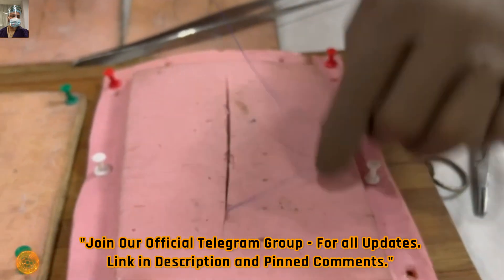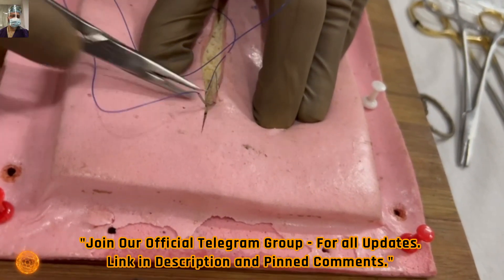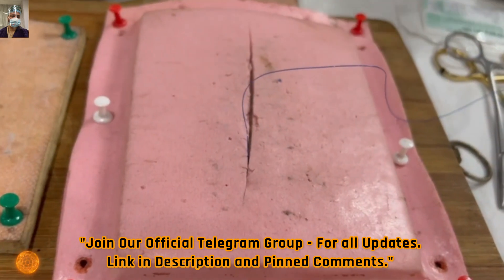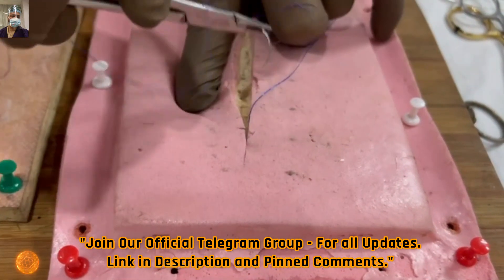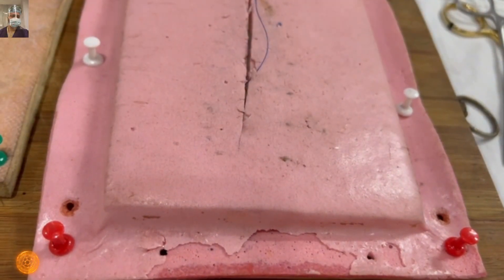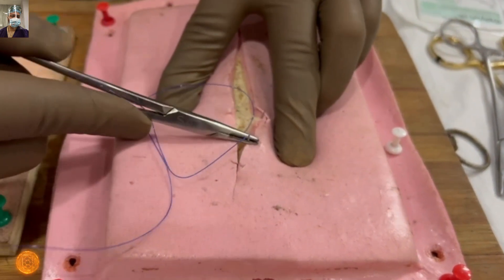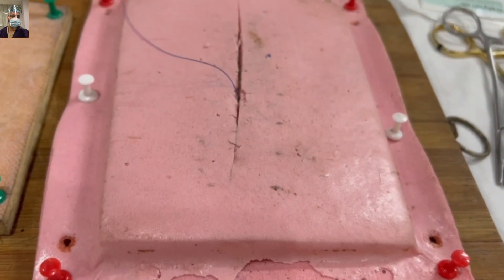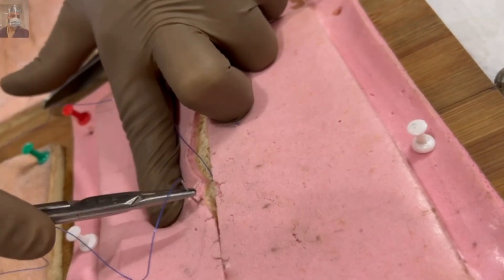All the bites are basically through the dermis or the epidermis-dermis junction — do not take part of the skin. The trick is knowing your exit point for the next suture: simply cross the suture to the opposite side, and where you exited on one side will be the entry point on the other side. As you keep progressing and keep learning, you will find your own unique way and unique rhythm. Most of you will modify this technique according to your own comfort and experience — these are just your starting point and a simple guide.